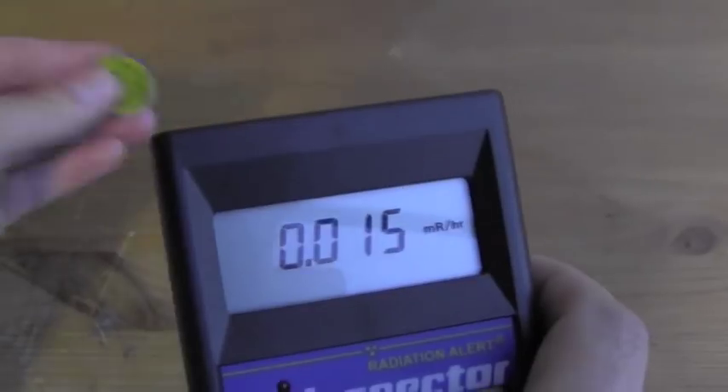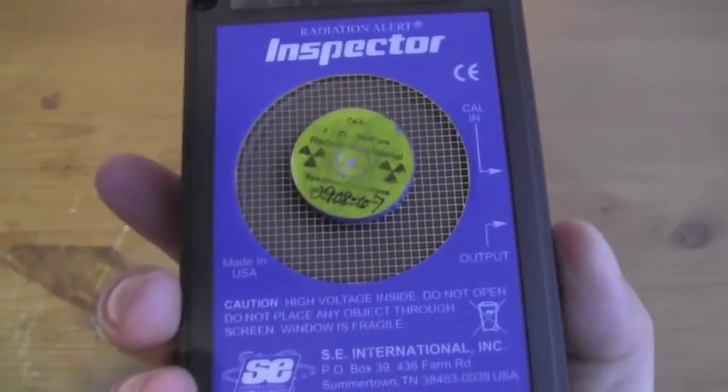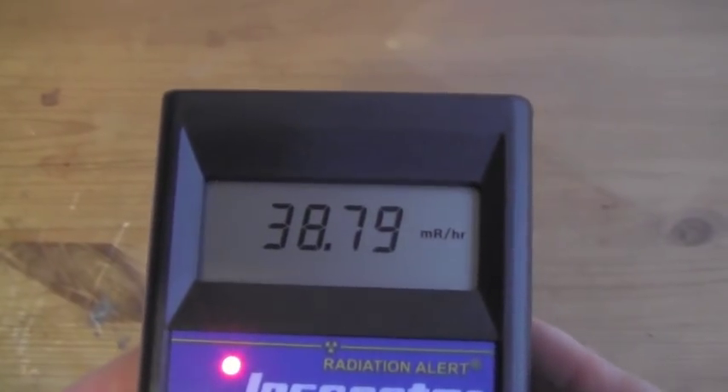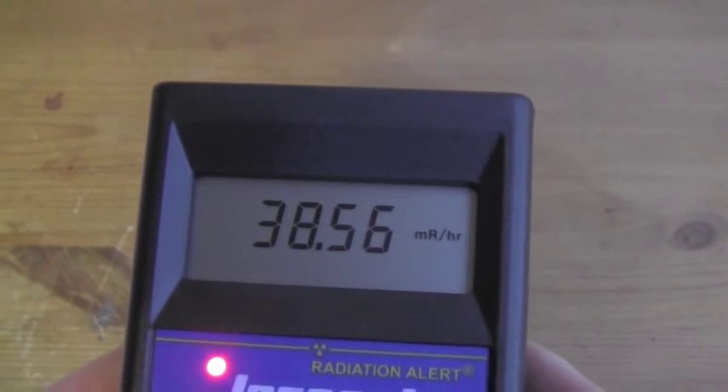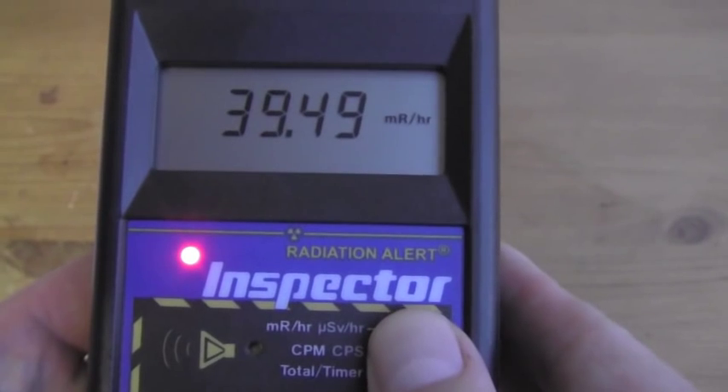We're going to place our cesium-137 check source on the window of the internal GM detector. We have a really fast response here in millirems per hour. We're going to change that to CPM.